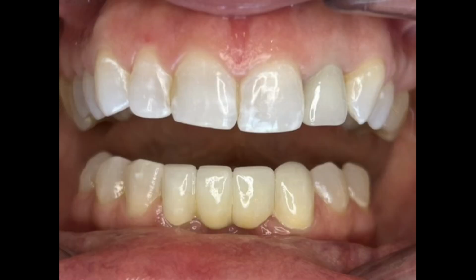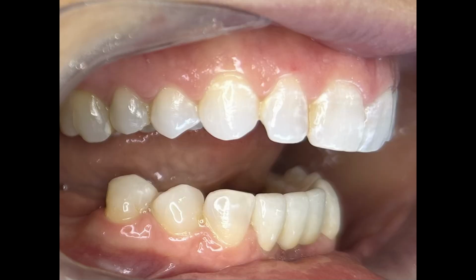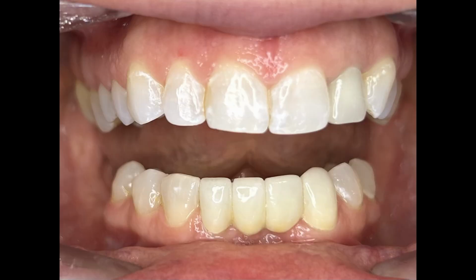That is then cemented in the patient's mouth, and the patient leaves happy and chewing and functioning just the way they're supposed to. And as you can see in these different photos that I've included here, we have pictures of the bridge, how it fits together, and how it's custom stained to match her natural teeth next door.